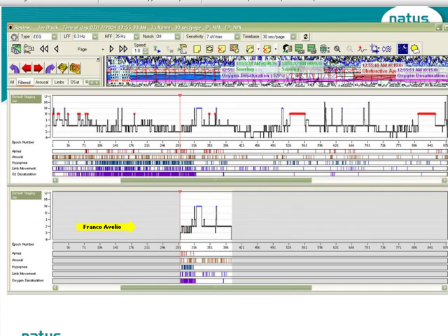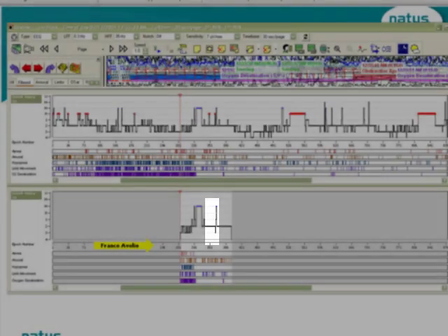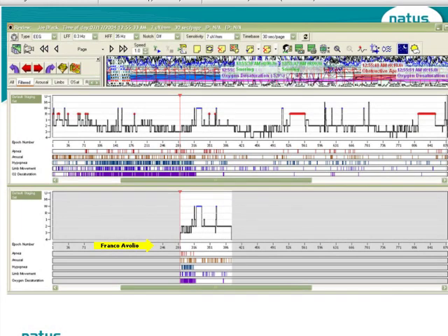You'll notice that there is a slight difference in terms of how the auto-staging analyzer works, and the difference appears to be mostly with the detection of REM. You don't see the REM sleep down here. So my point is, it's the same study, but because we don't have the first part of the recording, or at least the part of the recording where we expected the patient to be awake, it's actually affected the outcome of the staging hypnogram. It's ideal that you start your auto-staging at the very beginning or after lights off, but ensuring that the patient is still awake when lights off occurs.